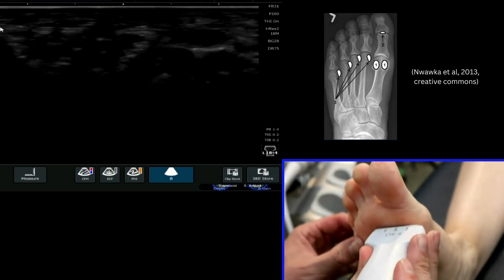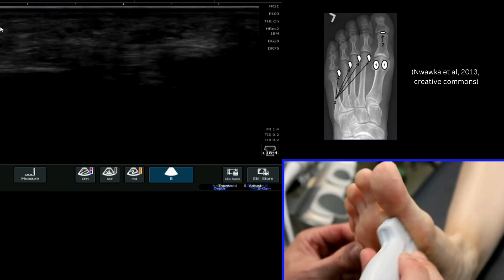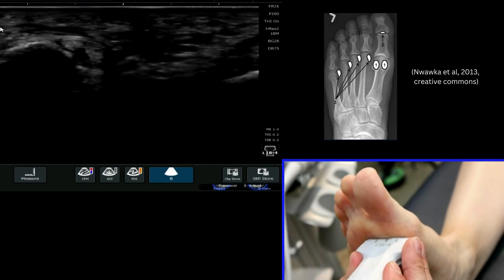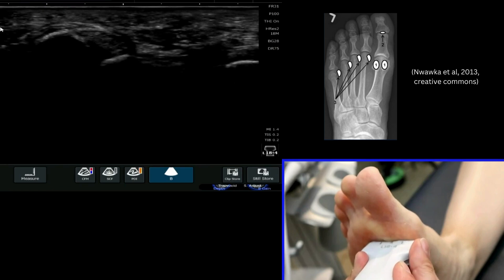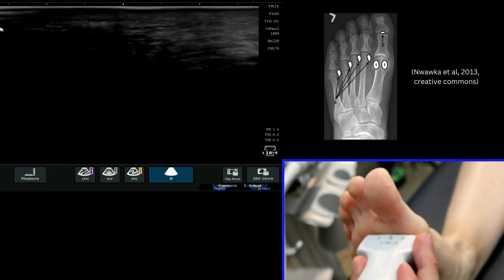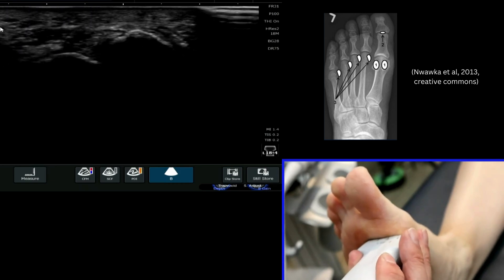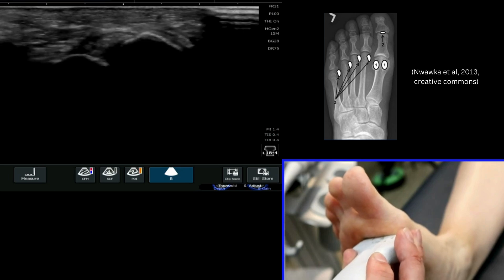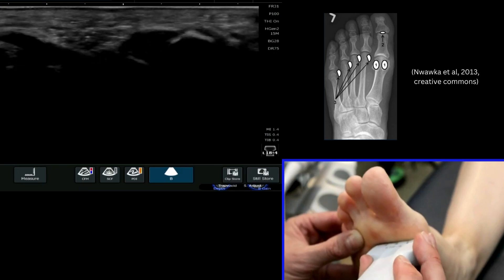We're now going to have a look at the sesamoid bones underneath the first metatarsophalangeal joint. The first thing you've got to bear in mind with this evaluation is your machine settings. On an 18 megahertz frequency I'm not getting the clearest image of these sesamoid bones — I can see them but they're not as clear as they could be. I'm going to reduce my frequency to try and obtain greater penetration. I'm now on 15 and I've got a slightly better view of those two sesamoid bones.